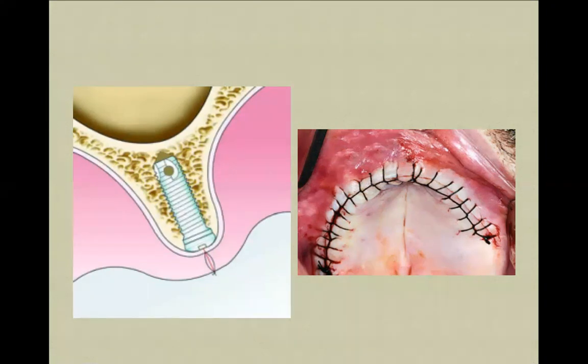And if you place this kind of suture, you have to remove it completely, do the unscrewing, and then replace it again. And that is just a little bit less by the time and anesthesia than the initial procedure.